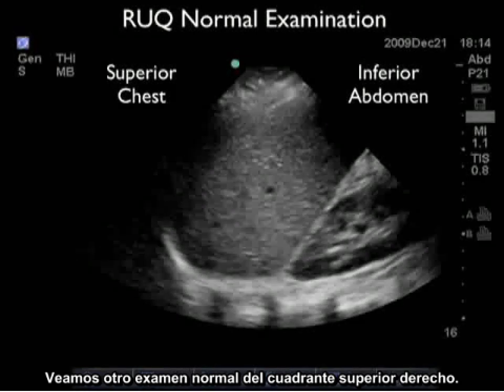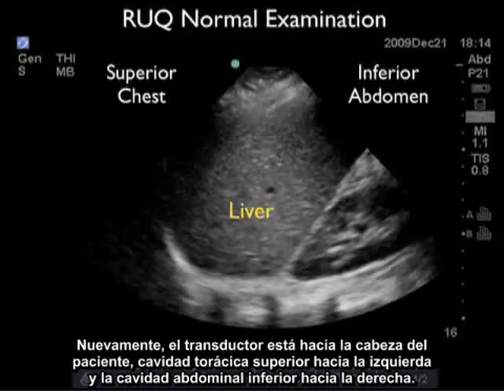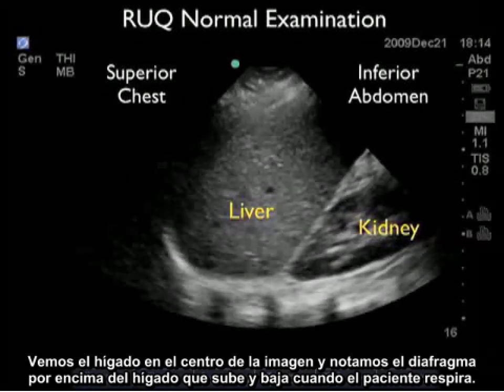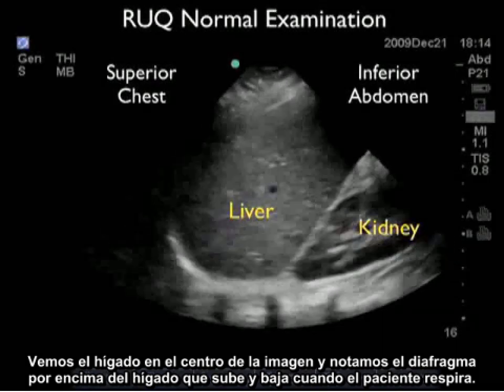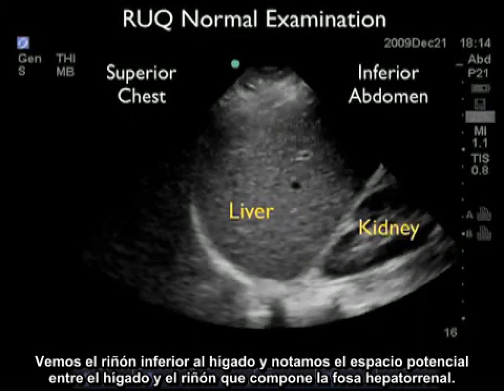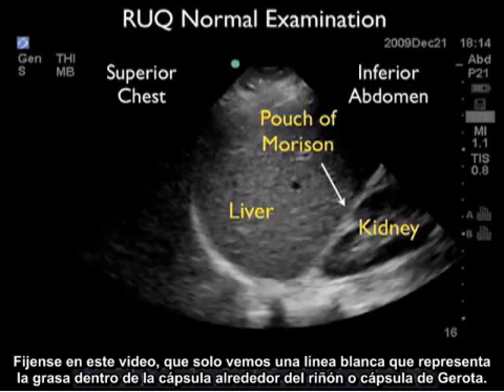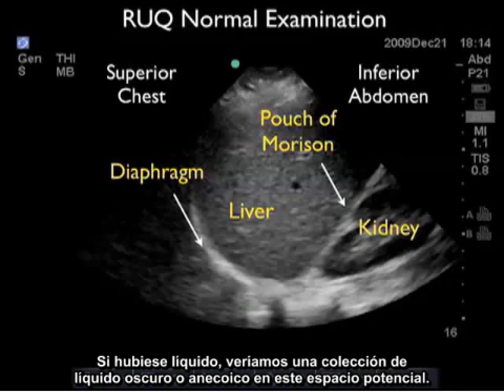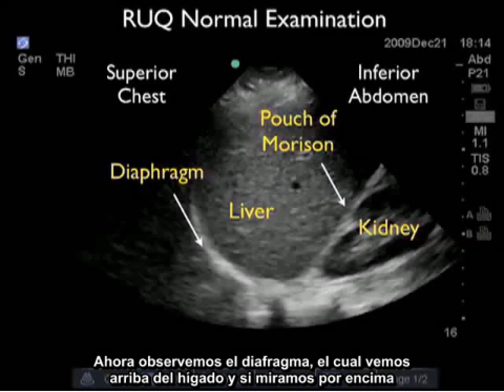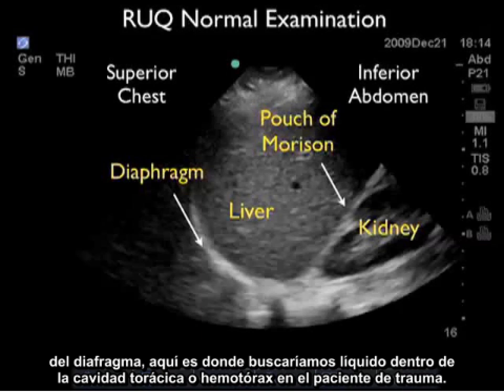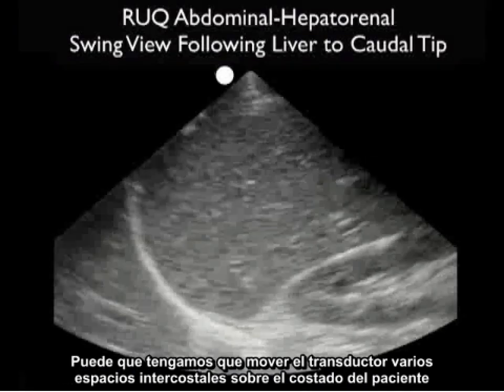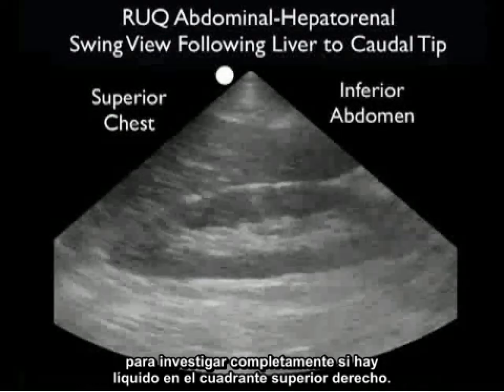Let's take a look at another normal right upper quadrant examination. Again, the probe marker is towards the patient's head, superior chest cavity towards the left, inferior abdominal cavity towards the right. We see the liver in the middle of the image, and notice the diaphragm above the liver moving up and down as the patient breathes. We see the kidney inferior to the liver, and notice the potential space in between that makes up the hepatorenal fossa, or pouch of Morrison. All we see is a white line representing the fat within Gerota's capsule. If there was fluid, we would see a dark or anechoic fluid collection in this potential space. Above the diaphragm is where we would look for fluid within the chest cavity, or hemothorax, in the trauma patient. We may need to move the probe several intercostal spaces on the patient's side to fully investigate the right upper quadrant for fluid.